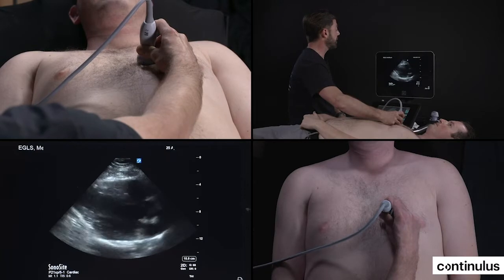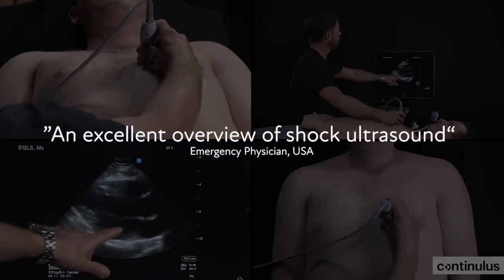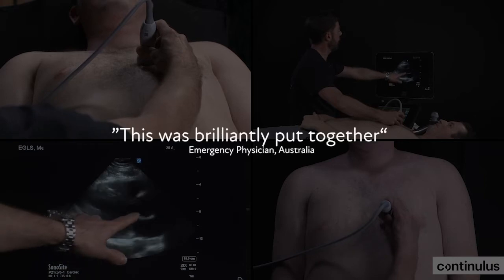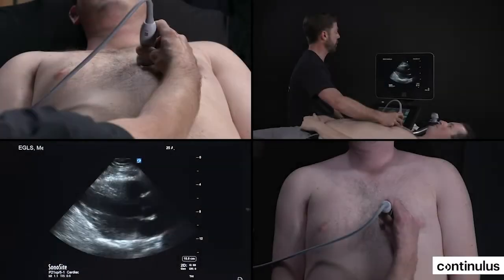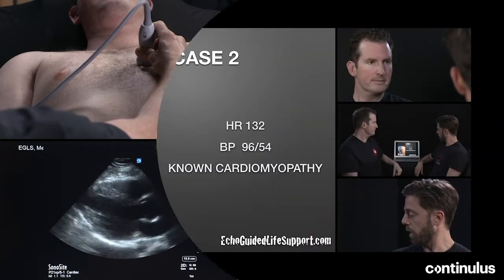Now step three: you have to watch the screen and see, do I have a nice view of both the mitral and aortic valve? If that's the case, you're done. If not, what you need to do is to tilt the probe.